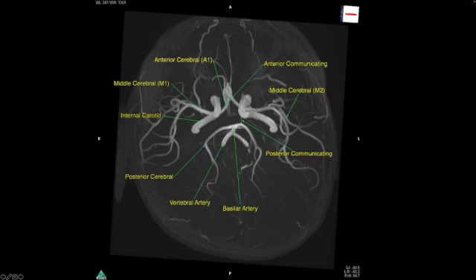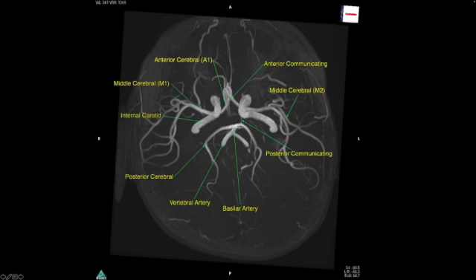This is an MRA of the head performed on a three Tesla magnet. This is kind of a top-down view of the intracranial circulation. You can see the internal carotid arteries come up. Here's the A1 segment of the anterior cerebral artery. Here's the middle cerebral artery that sweeps back along the sylvian fissure.